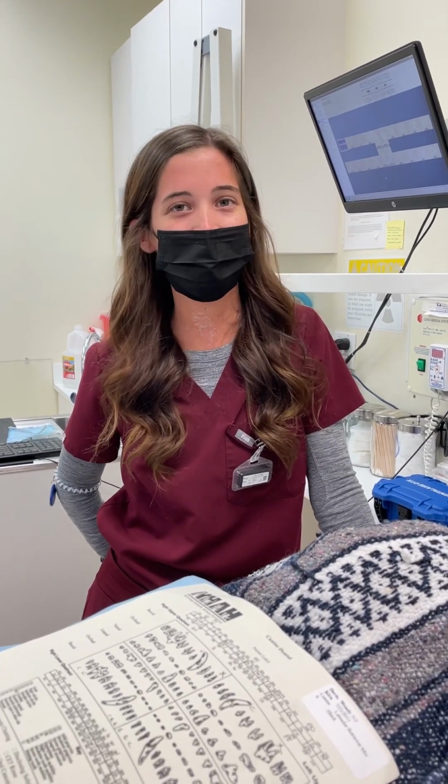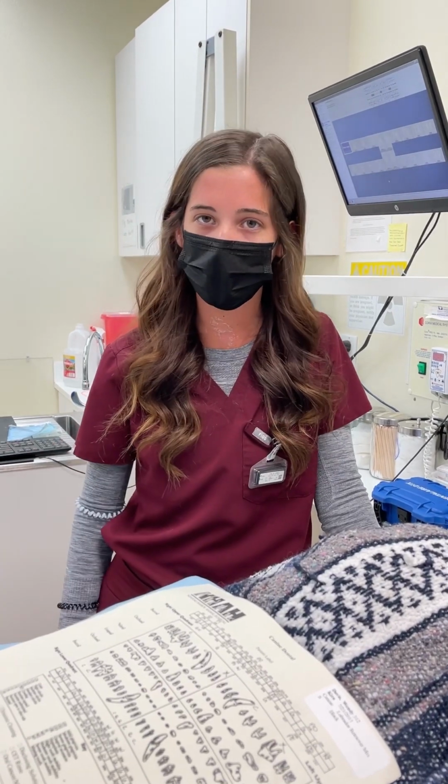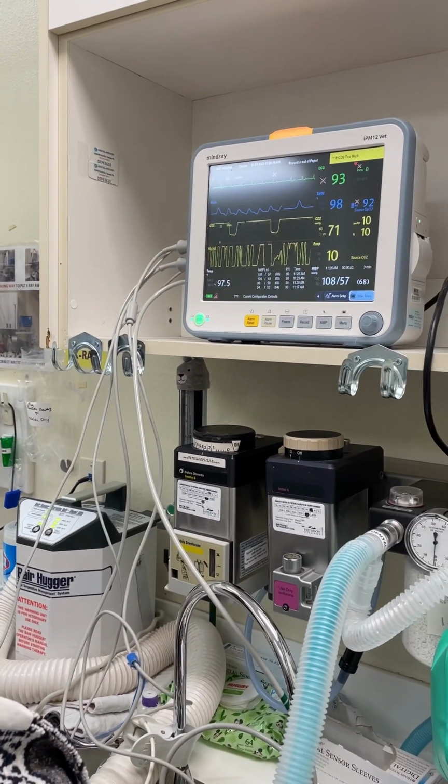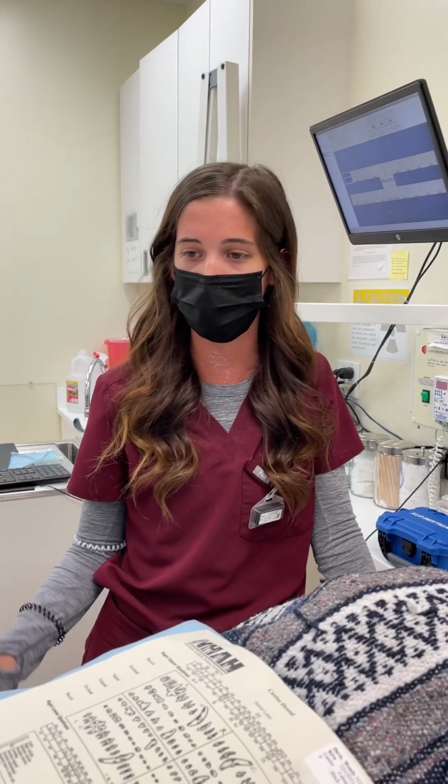Hi there, I'm Chloe. I'm one of the technicians helping Dr. Ashbran with this dental today. My job as the technician is to get the whole station set up in the morning for the patient, and then when we're all ready and the patient is under, we're going to go ahead and clean the teeth while the doctor is monitoring the anesthesia. And then we do the x-rays so we can see the gum line, make sure everything is good in there, and then when the doctor is doing extractions, if there are extractions, I am in charge of monitoring the anesthesia.